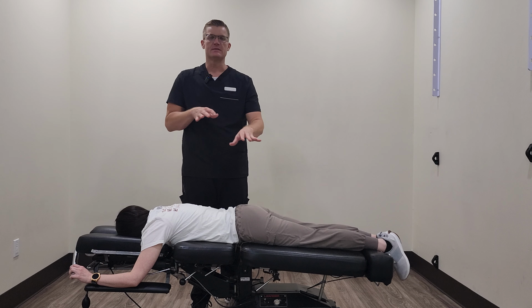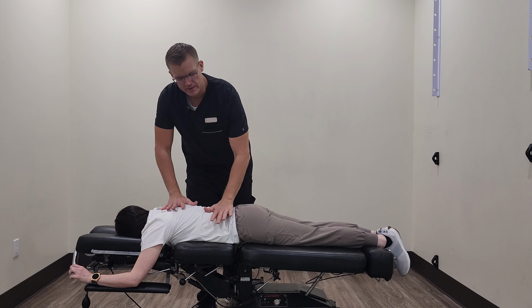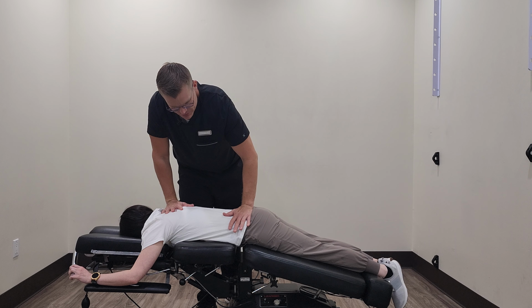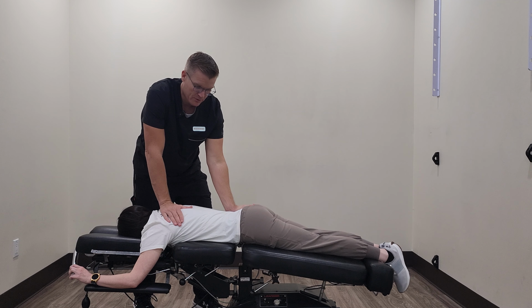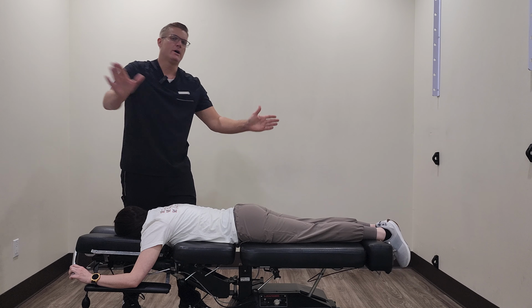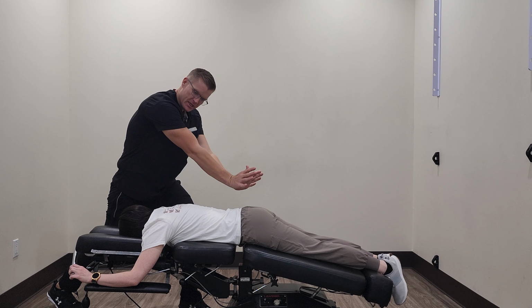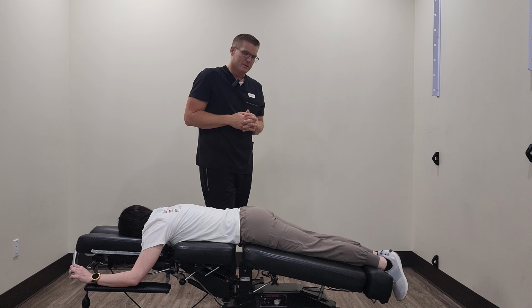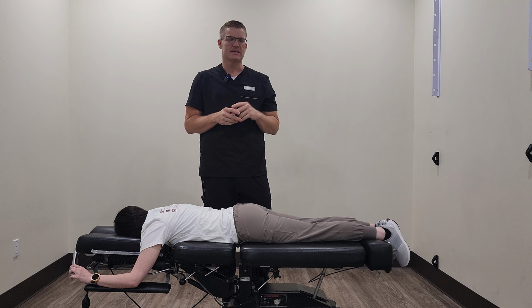There's a couple other things that we normally would do, some different stretches as that table goes down. We utilize that table and just stretch you apart like that. Now Chelsea's a lot smaller, so we don't need to put a lot of force into her. But I've had patients as big as 450 pounds where we literally are pushing with quite a bit of force to help traction and open that up. But that's how flexion distraction technique works, and that's why it works so very well.